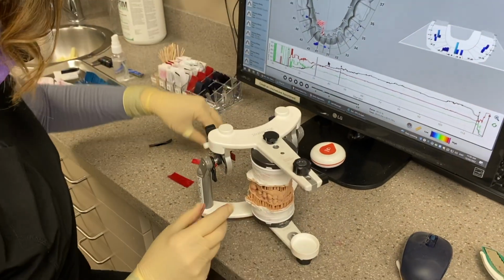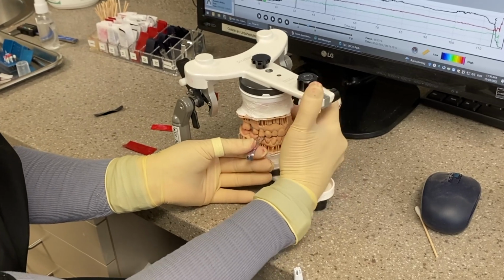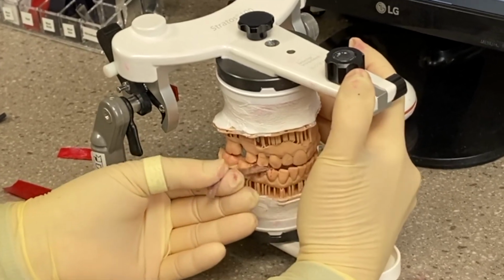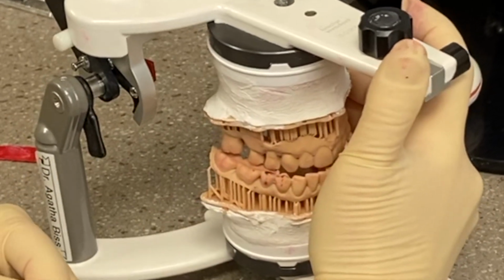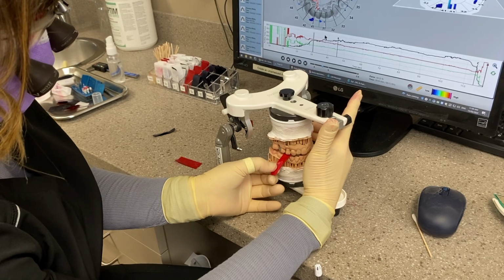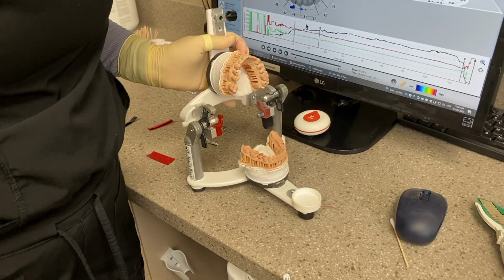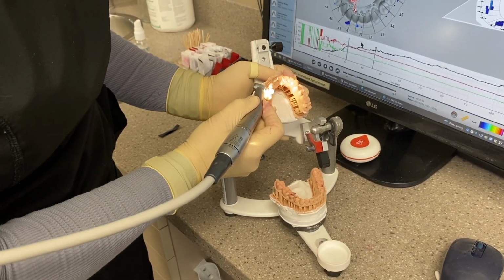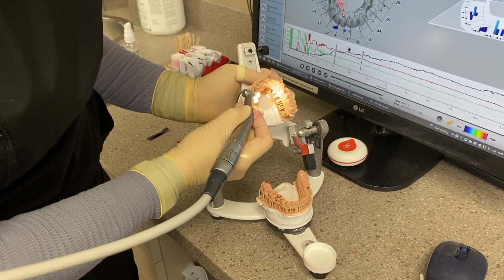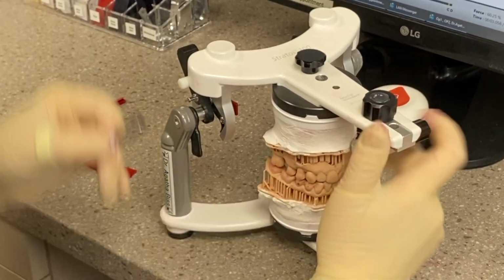Okay, let's try that again. Let's make sure it goes with shim stock. There should be no contact on that bicuspid in a slide, and there still is when she comes over. Now the likelihood of her coming over that far is low, but we're already doing it, might as well, right? That way we can reshape that tooth into ideal position. So I'm just going to take out that buccal cusp completely here. And we're fully on the canine, and everything else is free. So this side is good.